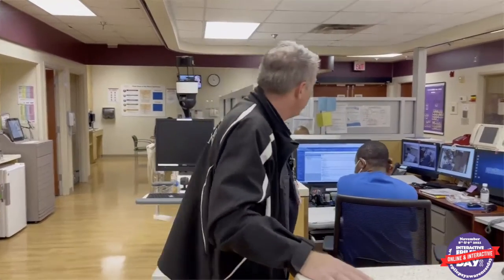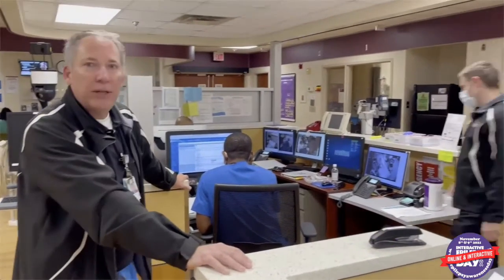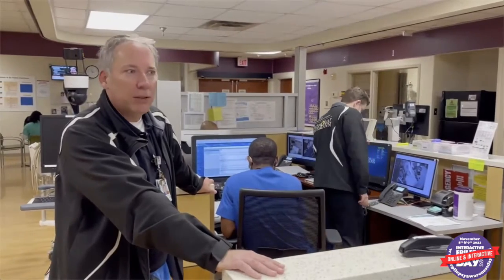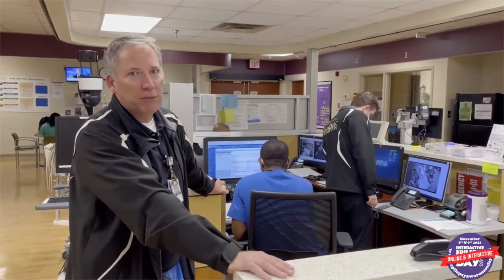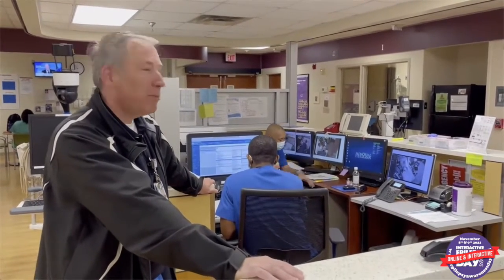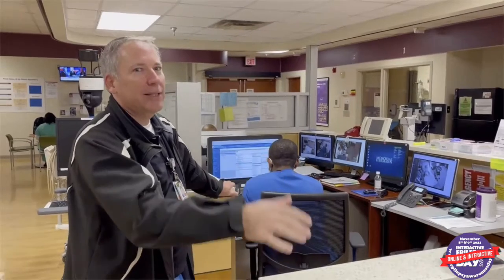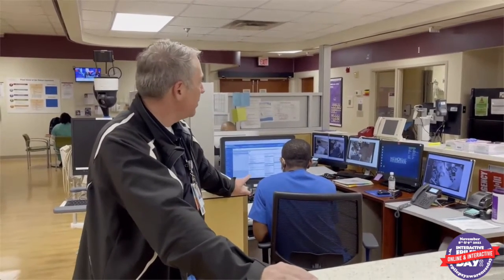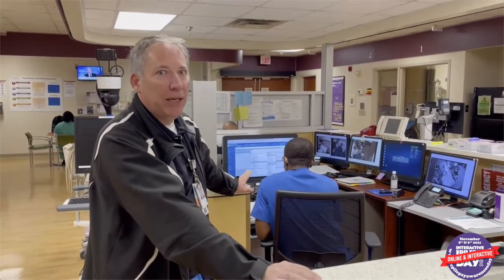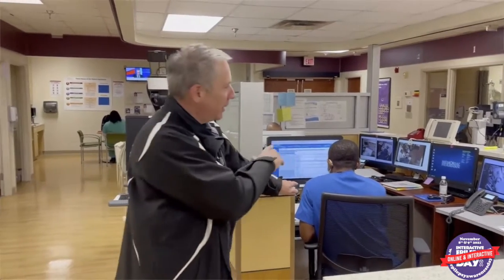So we have 2 nurses here. One of them is constantly watching videos while the other one is writing notes or visiting patients' rooms during that time. This is also where we receive the alarms coming from the patient's room. A family member can press the alarm button. The technicians can press the alarm button. Or if you see something off on the screen, a behavior that is not according to normal behavior, then we jump in and go to the patient's room.